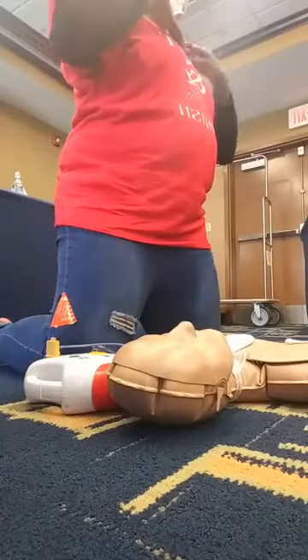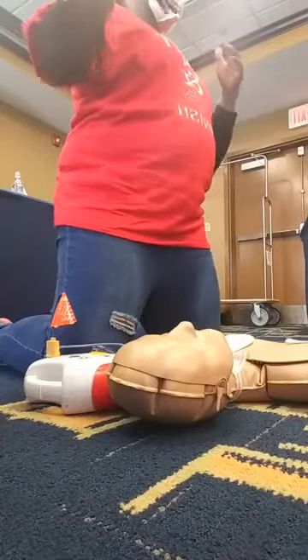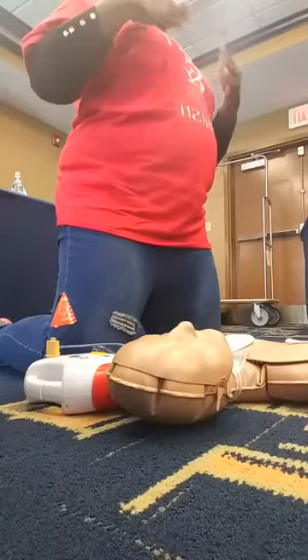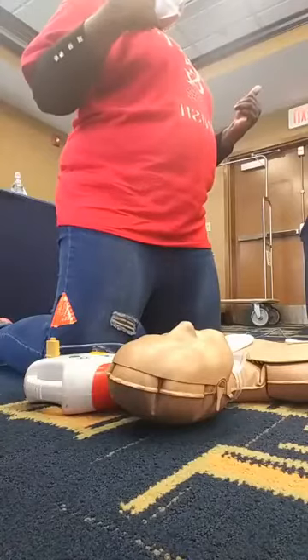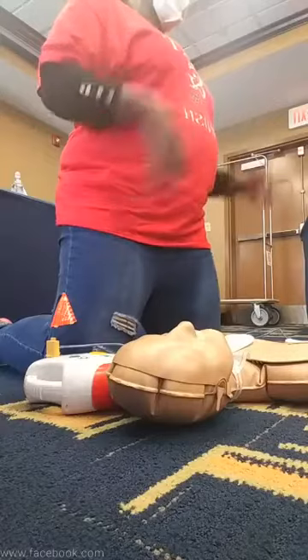And also, if they have any jewelry, any metal, you want to remove that as well, because the metal can interfere with delivering a shock. Ladies that have on bras, you do want to remove the bra, especially if it's an underwire bra, because the metal can interfere with delivering a shock.